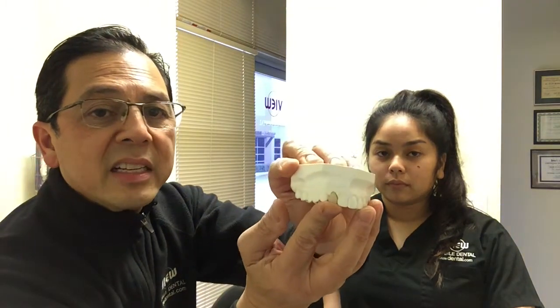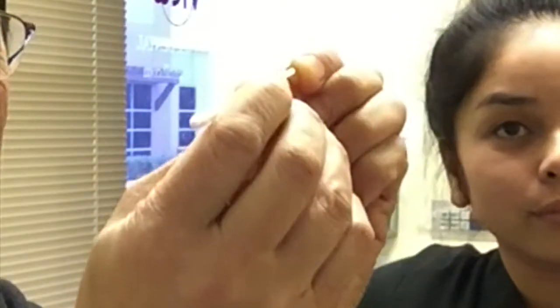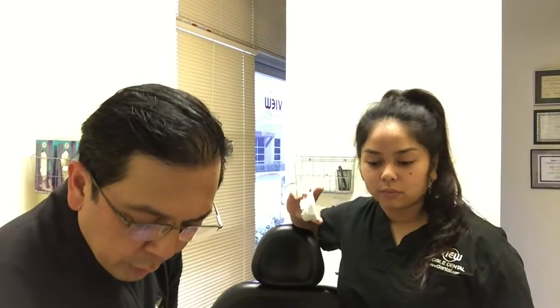And then what you want to do is put that right back. But if you don't have the paste, it will come off again just like this. What you want to do is go get a Q-tip and be able to clean the tooth, whatever is inside there. You could also use a toothpick to make sure that you clean the inside of the crown, and then try that back on.